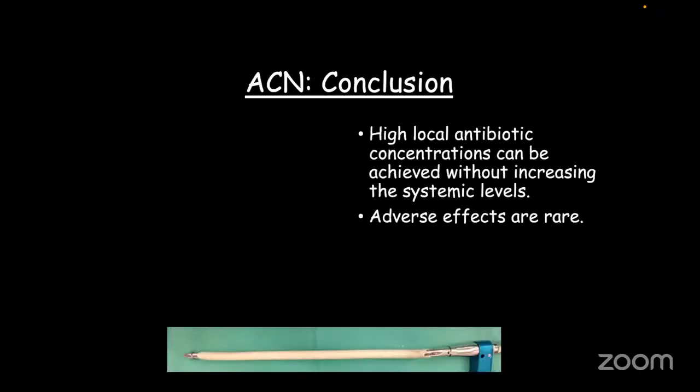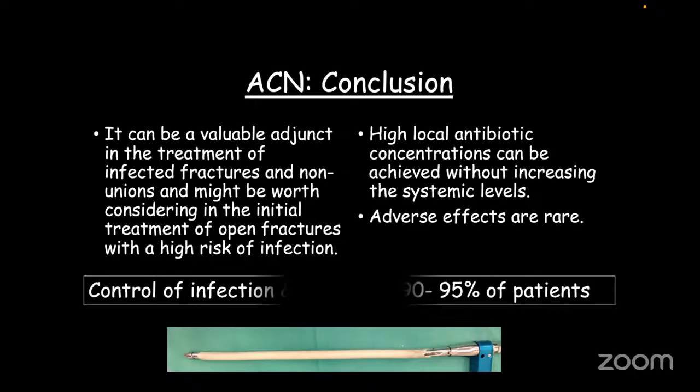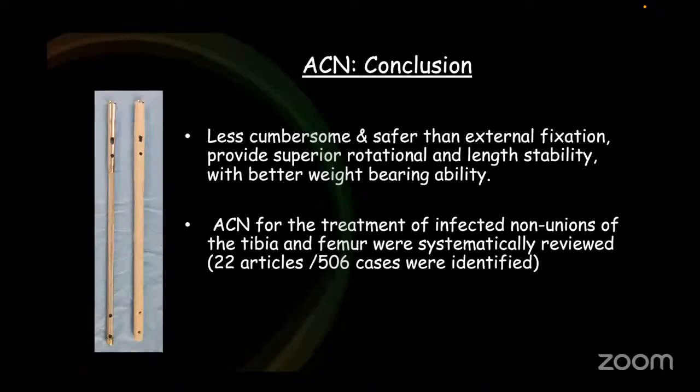Antibiotic coated nail, in conclusion: high local antibiotic concentration can be achieved without increasing the systemic levels. Adverse effects are rare, and it can be a valuable adjunct in the treatment of infected fractures and non-unions, and might be worth considering in the initial treatment of open fractures, which have a higher risk of infection. Control of infection and success is almost 90 to 95% with the antibiotic nail. Less cumbersome, safer than external fixation.